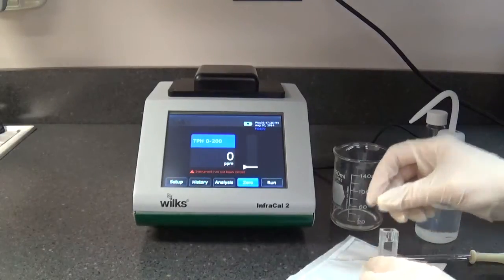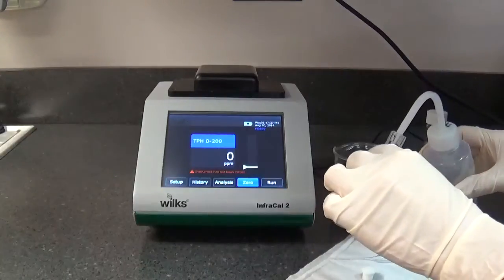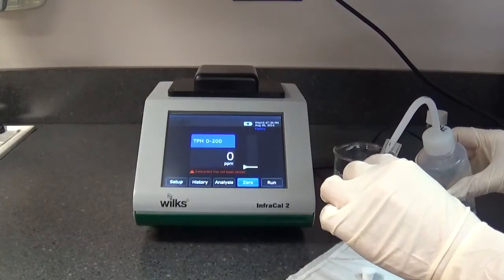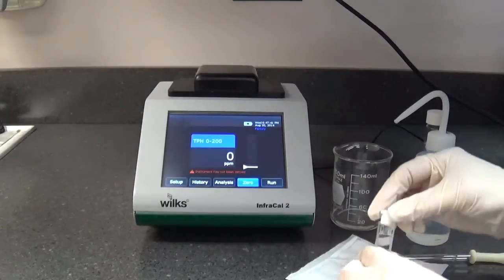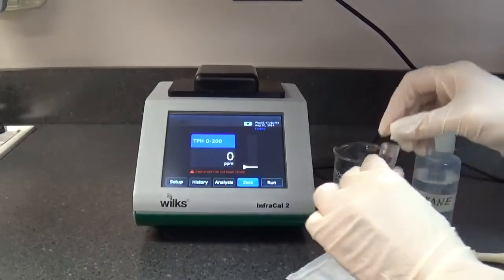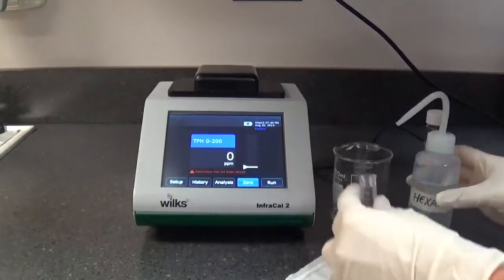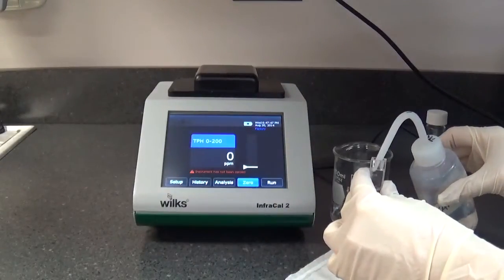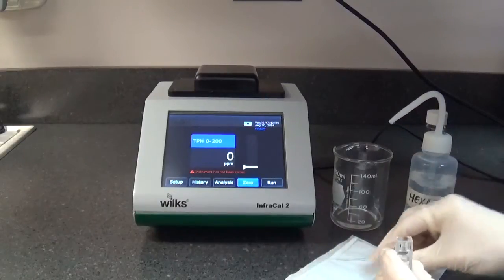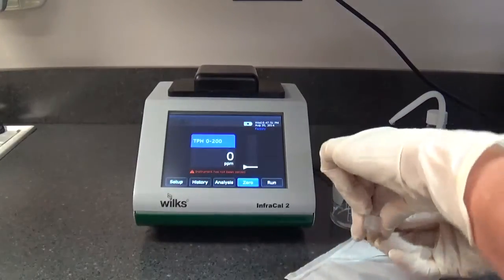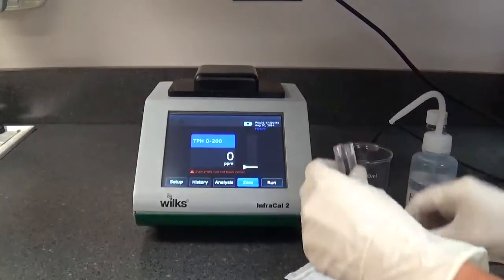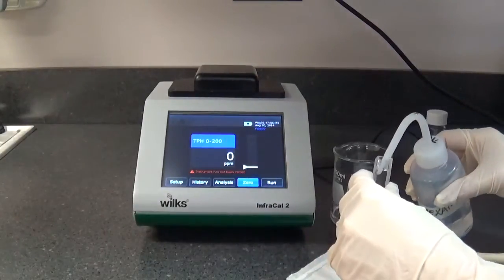Ensure that the cuvette is clean. Hexane is recommended for cleaning as it evaporates more quickly than tetrachloroethylene or S316. To clean, fill and empty the cuvette two to three times. Allow the hexane to evaporate prior to filling the cuvette with zero solvent. Do not use water to clean the cuvette.